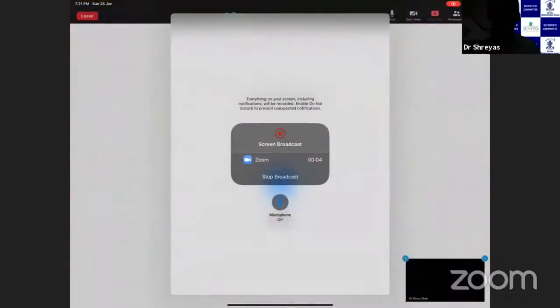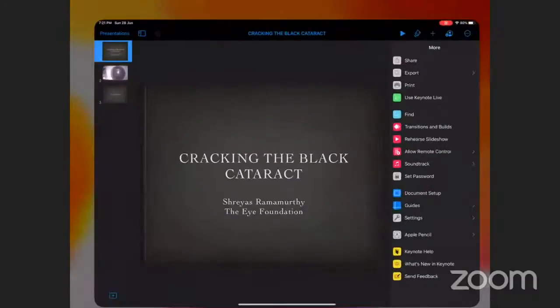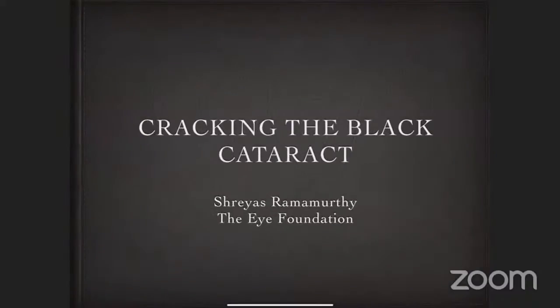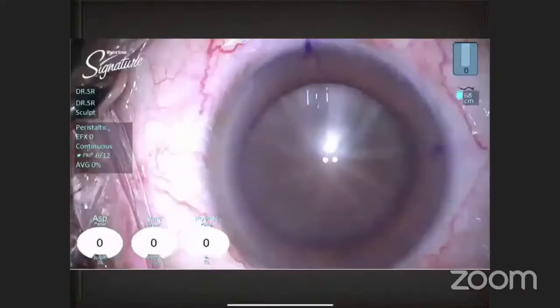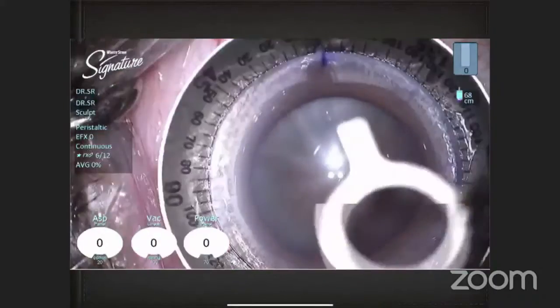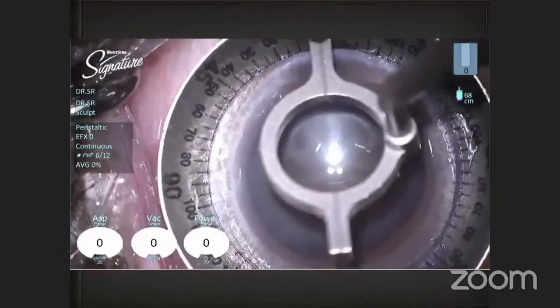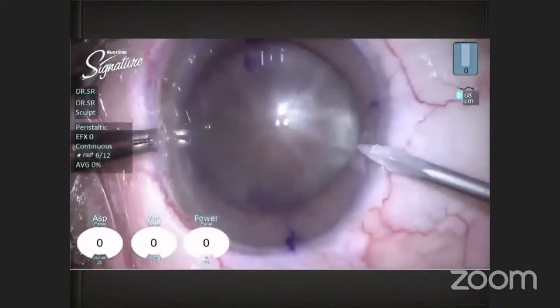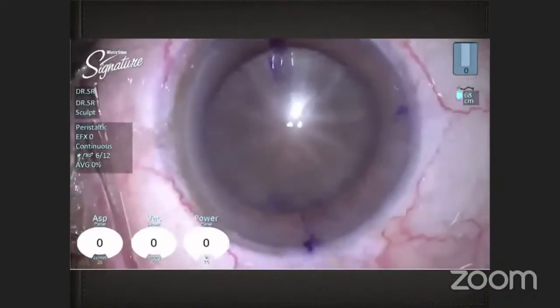So today I've been asked to talk on cracking the brown and black cataracts. I don't have a formal presentation, but just a couple of videos which I'll keep under 4 minutes. So I'll start off with the case directly. This is a grade 4 to 5 nucleus, and this was a patient who was also wanting a toric multifocal lens. So you can see the toric markings in place.